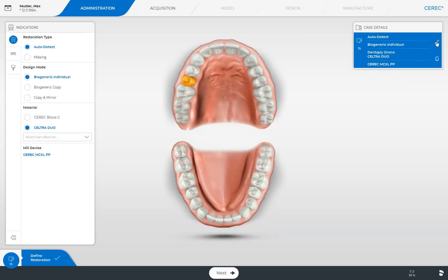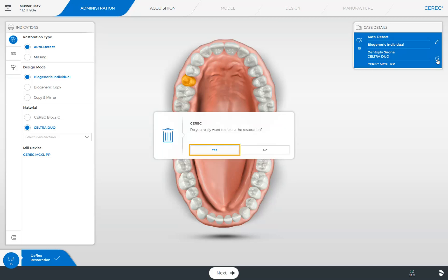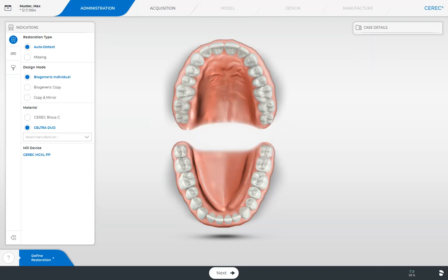The complete restoration can also be deleted from the case details. To do this, tap the waste bin icon and confirm with Yes. It might be possible that your patient is missing a tooth but the gap is closed. In this case, the corresponding position should be entered as missing in the odontogram. Based on this information, the CEREC software can create a first design proposal with a correct morphology.